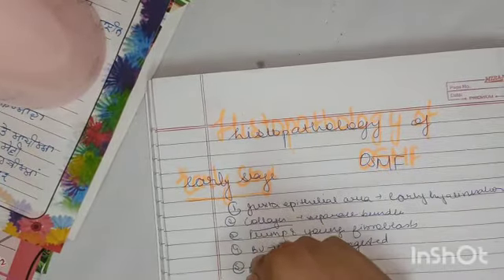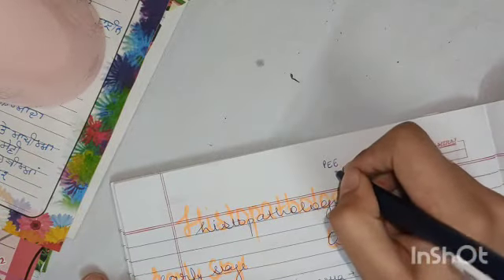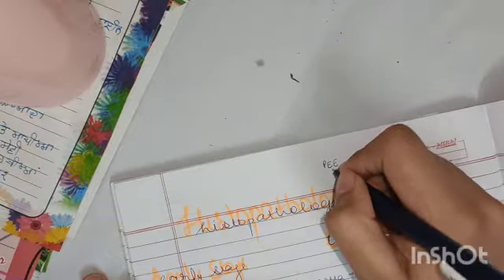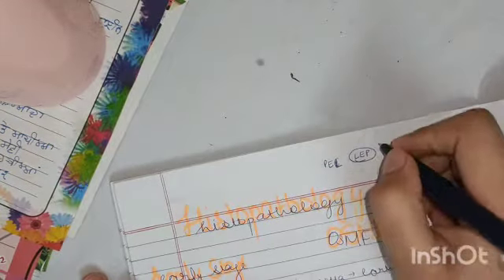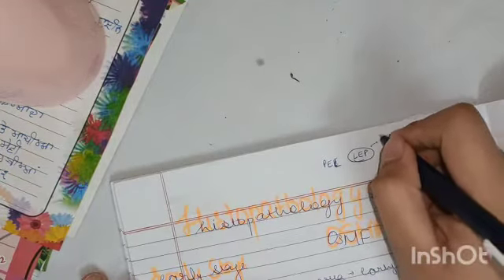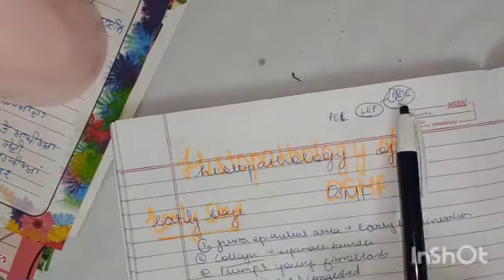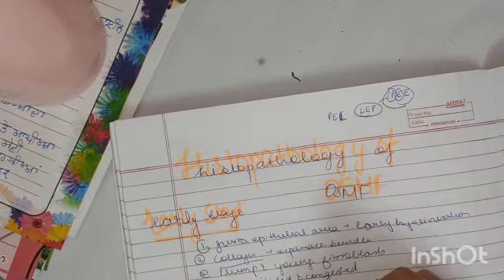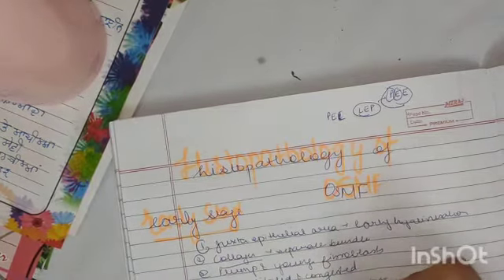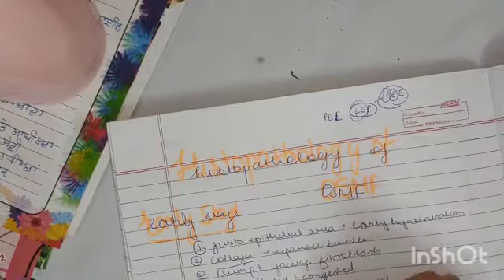Also, the inflammatory cell infiltrate, what you will recognize is that basically we will have only three types of cells, that is plasma cells, eosinophils, and lymphocytes. So you can remember it as LEP, okay, as LEP. But what you will see is the characteristic pattern of the predominant cells. You have to remember P. In the first one we have P in front, so you will write the plasma cells as being the occasional ones, and the rest two, that is after P, being the predominant ones, that is lymphocytes and eosinophils.